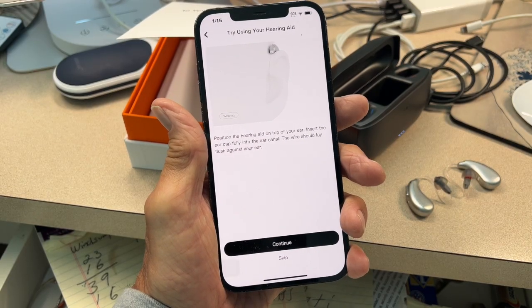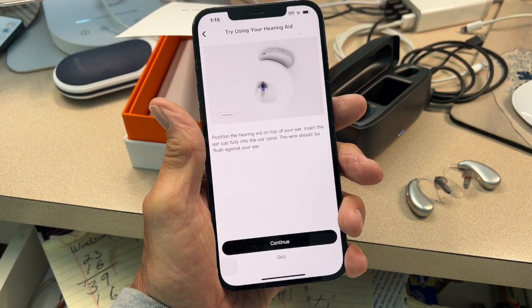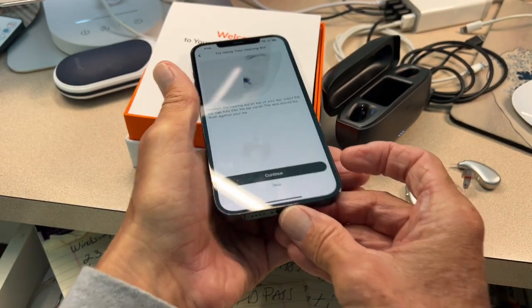Okay, position the hearing aid at the top of your ear. Insert the cap fully into your ear canal. The wire should lay flush against your ear. Okay, so we got to do that, right?